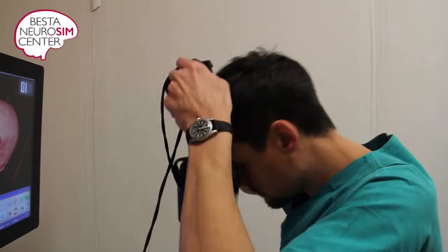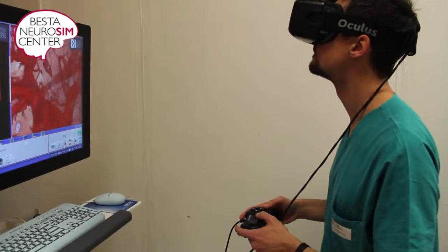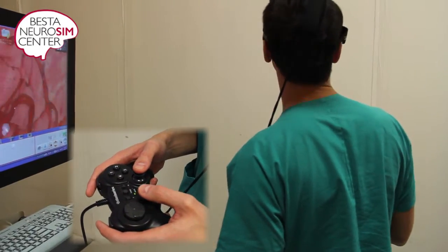Good morning and welcome to the aneurysm clipping task. In the first part, you will have three minutes to familiarize with the patient's anatomy and freely navigate with the Oculus device and joypad.